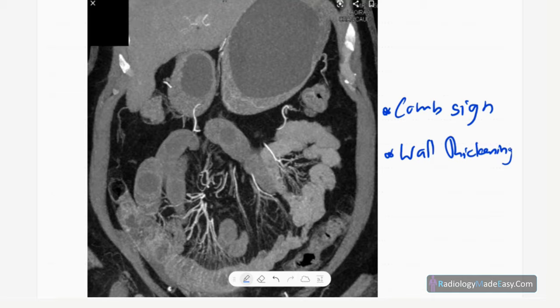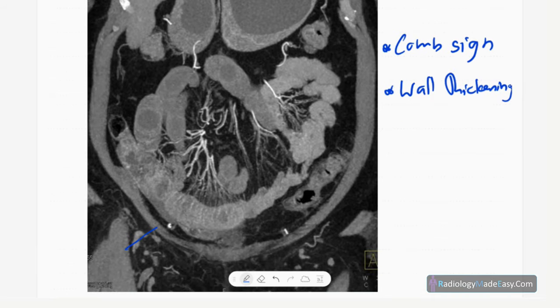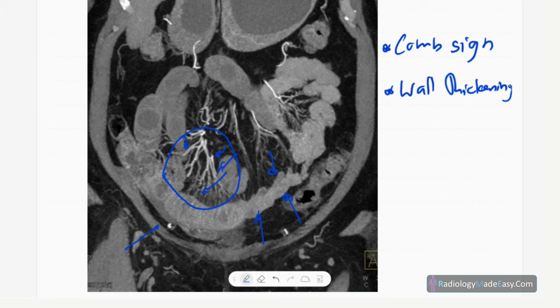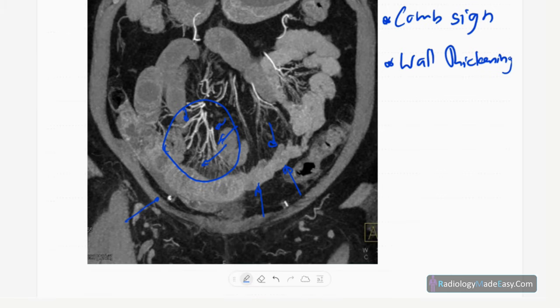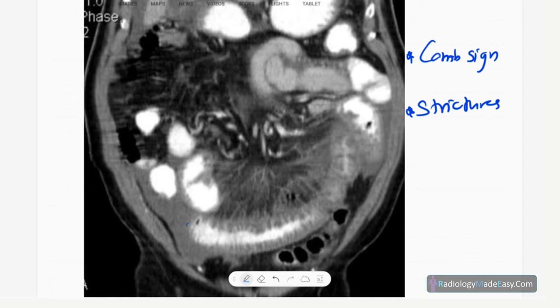Now let's look at CT images. This is a contrast CT coronal reformatted image showing bowel wall thickening and venous congestion giving rise to the comb sign — an example of Crohn's disease. Bowel wall thickening with prominent mesenteric veins is due to venous congestion and inflammation. Thickened ileal loops with venous congestion are also seen — this is the CT comb sign.